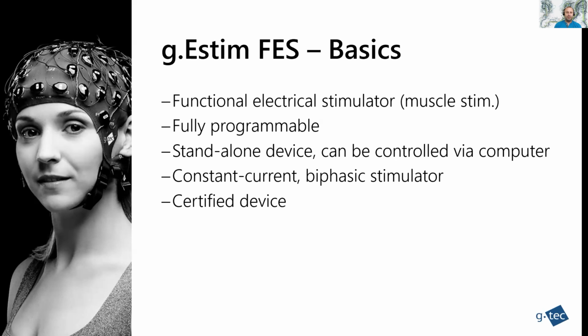So we use the system mainly in our RecoverX application that you will see later this week, but you can also use it for research purposes, of course. In Simulink, when you use it there, it's out of the certification range, of course, because the software is not certified, but the device itself has the certification.